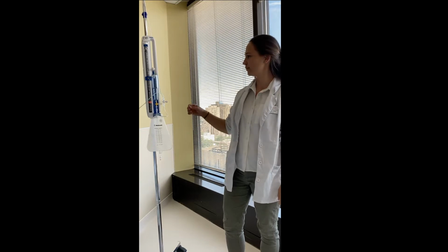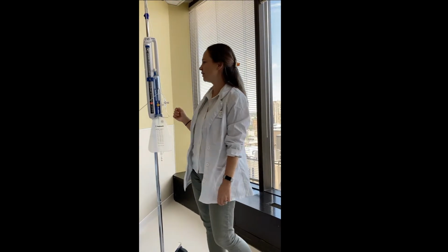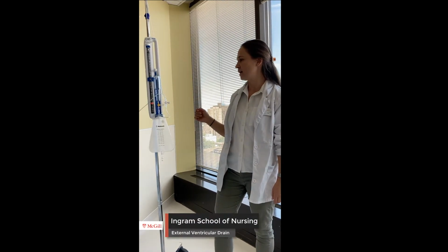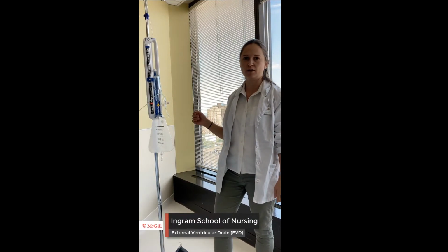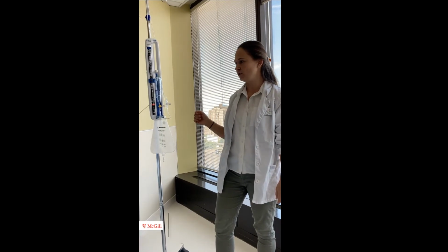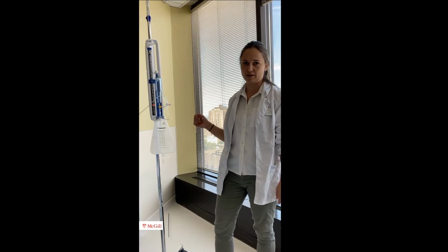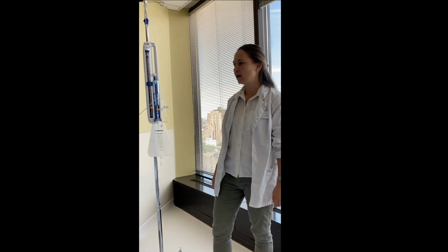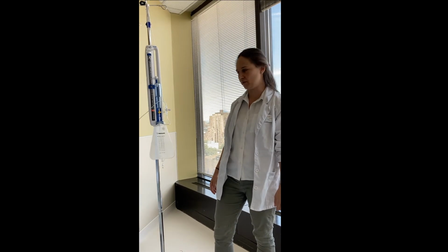Hi everyone. So the purpose of this video is to talk about the external ventricular drain. This is a drain that would be inserted into the patient's ventricle. For this video, you should review the anatomy of the human brain, the ventricles, as well as the CSF, or the cerebral spinal fluid, where it circulates in the brain and as well as in the spine.